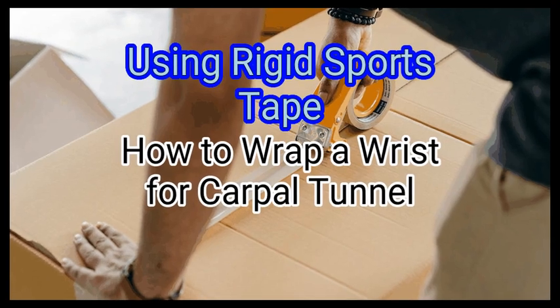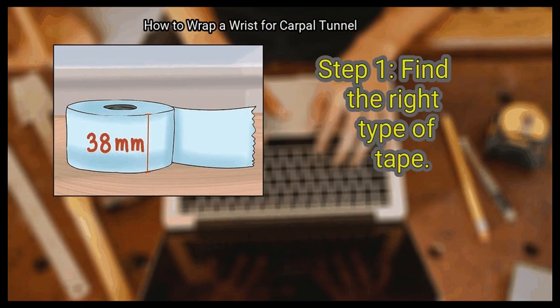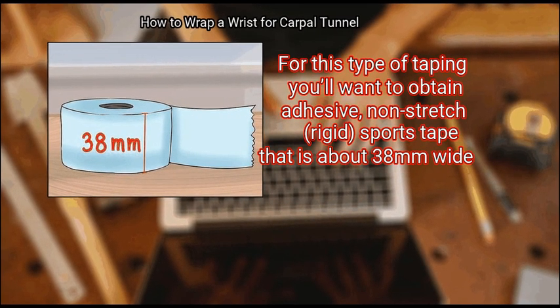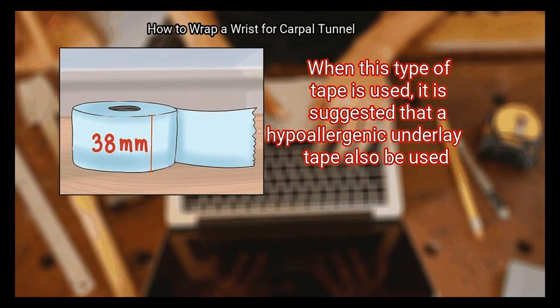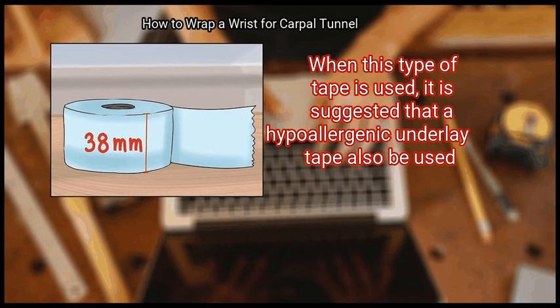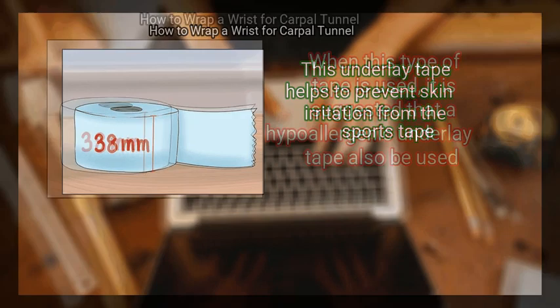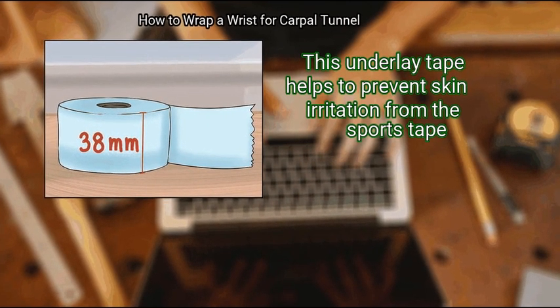Method 2. Using rigid sports tape. First is find the right type of tape. For this type of taping, you'll want to obtain adhesive, non-stretch, rigid sports tape that is about 38 mm wide. When this type of tape is used, it is suggested that a hypoallergenic underlay tape also be used. This underlay tape helps to prevent skin irritation from the sports tape.